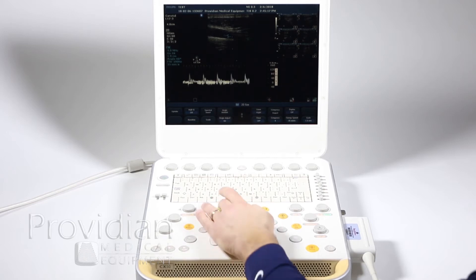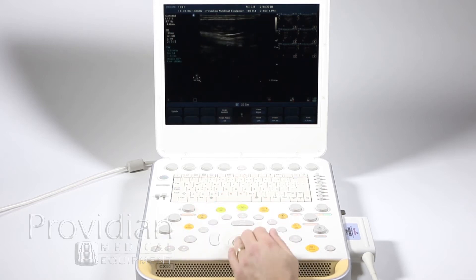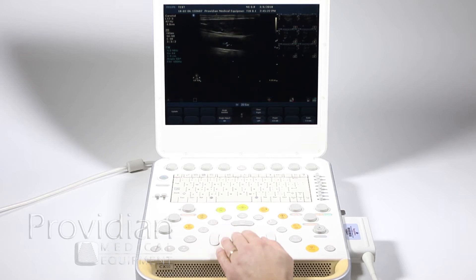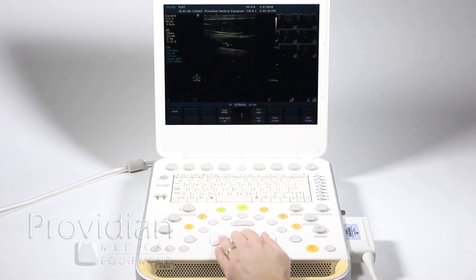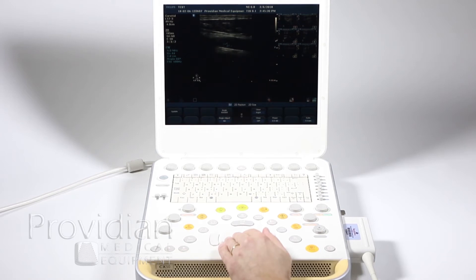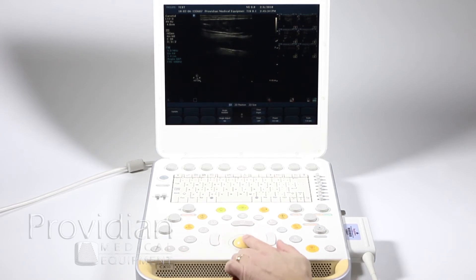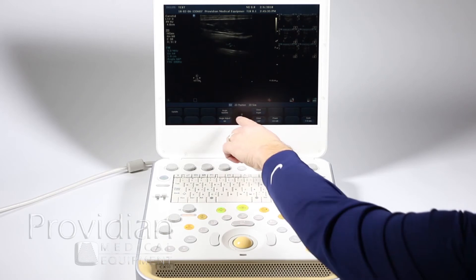Let's say I wanted to make some changes. I can change my gate size. Notice here by hitting this, the 2D size. I can change the sample position by using the trackball.